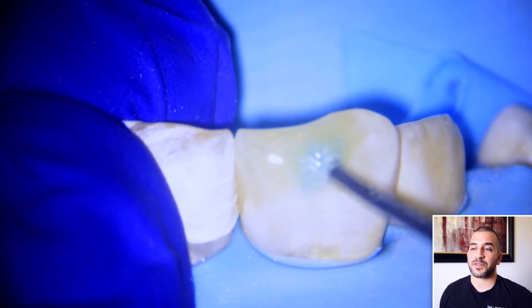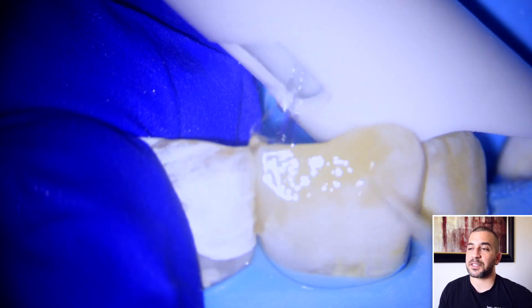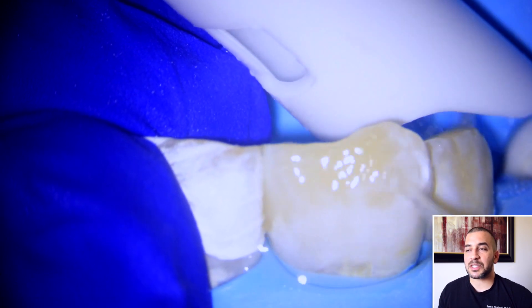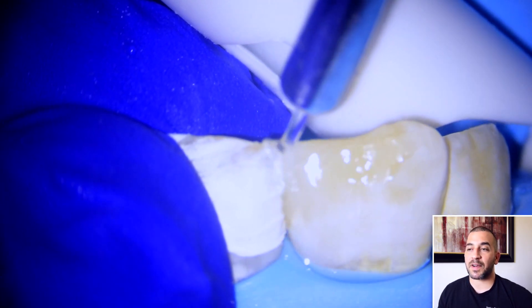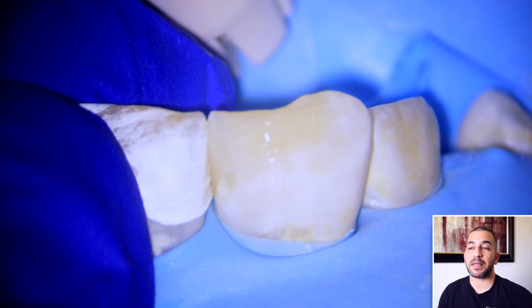Now before I place any phosphoric acid etchant, I do like to put a little bit of chlorhexidine on the tooth. That's an antibacterial agent that just helps clean the tooth and gives it a very sterile environment before placing any product on the tooth. So it's something that I like to do before any bonding.